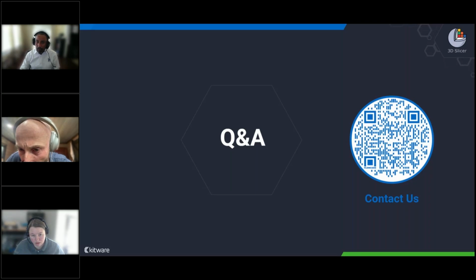So do people have any additional questions that you would like to address here? So I see a question about software modularization. And as we pointed out, that's what makes 3D Slicer very flexible and easy to use. Most of the logic and particular functionalities are modularized within Slicer modules, right? So if you are looking for help in that, feel free to reach out to us or ask a question on the Discourse.